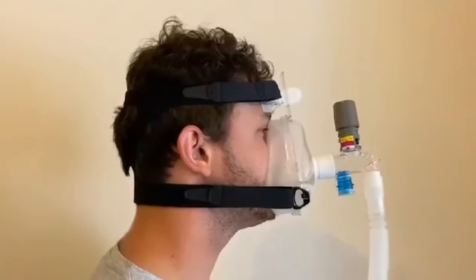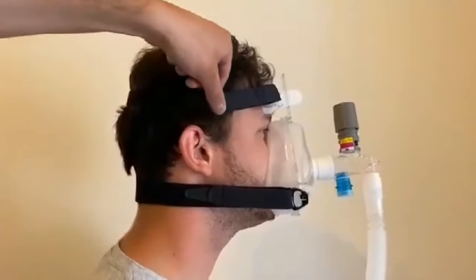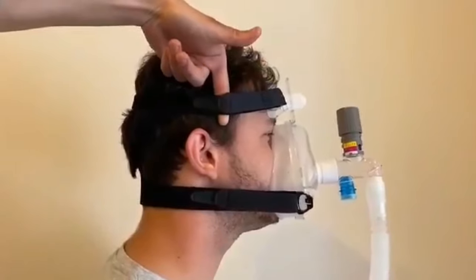When the mask is fitted correctly, you should be able to place one to two fingers between the headgear and the patient's head.